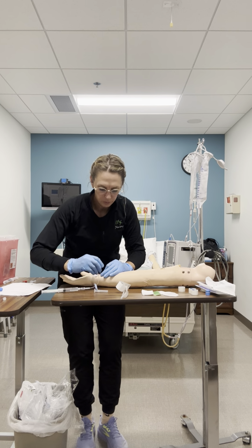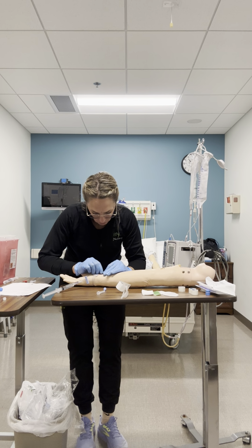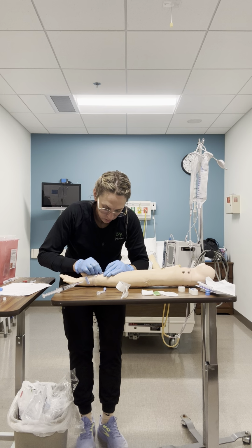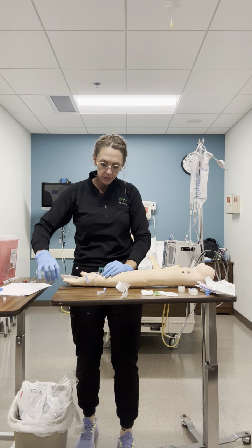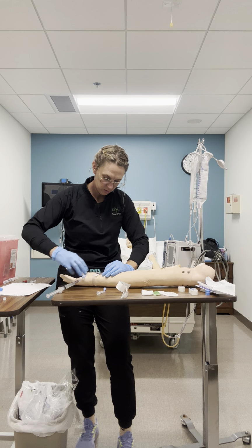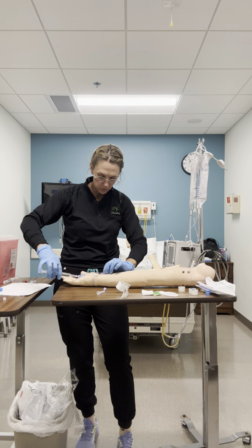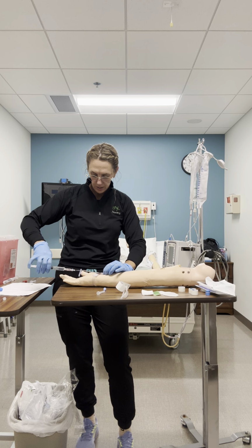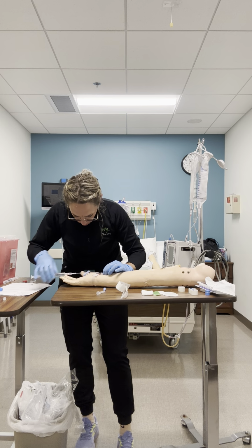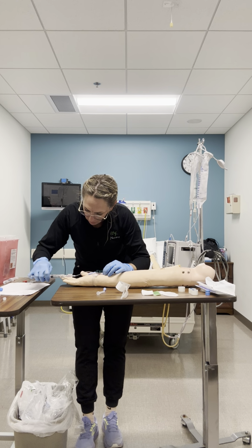Okay, at this point, we are going to pop the lid off of my primed tubing here, and we're going to check for patency, check to make sure everything looks good. I was putting some slight pressure up above the catheter just to make sure that we weren't losing blood. And then I'm going to do 3 to 5 mils for patency, attached right there. 3 to 5 mils.